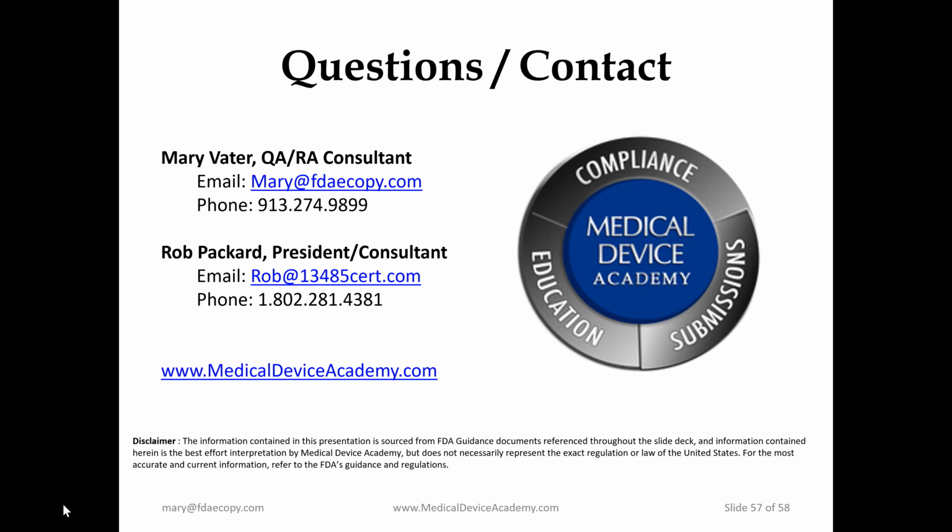The first question, I believe, was kind of answered by one of the audience. The question was, it seems to be the same for moderate and major levels of concern for documentation, except for the software development environment and revision level history. There was a table presented, but in the guidance it says which things are required for minor, which for moderate, and which for major. And there are some differences. They aren't tremendous, but maybe you want to comment on that a little bit more.